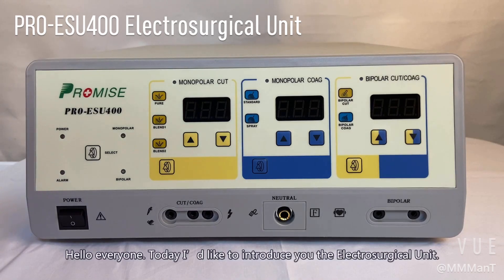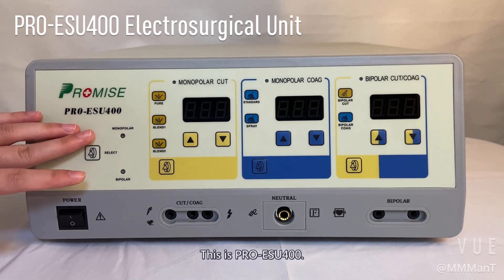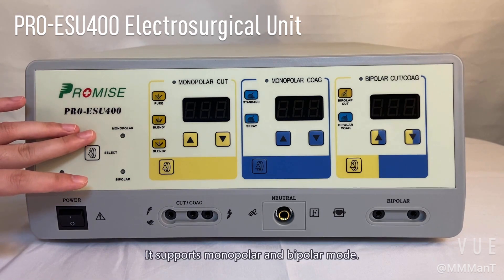Hello everyone, today I'd like to introduce you to the electro-surgical unit. This is PROMIS ESU-400. It supports monopolar and bipolar mode.